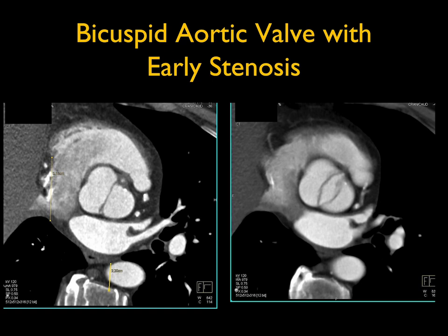Case 3 is a nice example showing why gated acquisitions are really useful for looking at the aortic root and aortic valve. Gated acquisition helps avoid overcalling dissection when it's simply motion artifact. With gated acquisitions you can see the aortic valve — take the coronal view, put a line right through the aortic root, and you can look directly at the aortic valve.